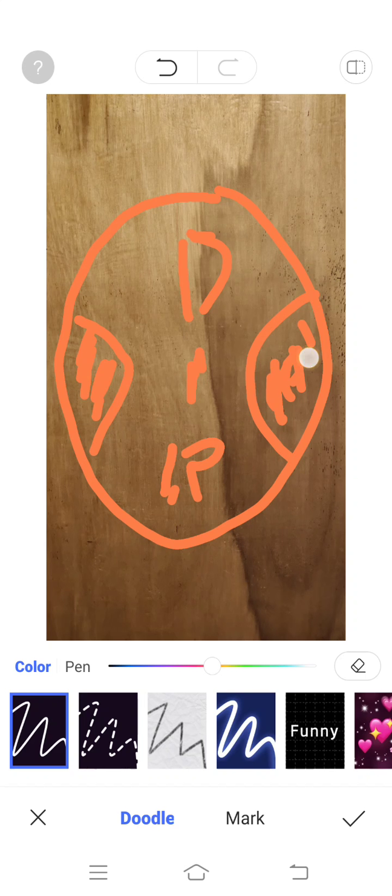If that happens, the vision will be a little blurry, but the worst is you will develop a headache. Okay, if you use that area for a long time, you will have this very scintillating headache.